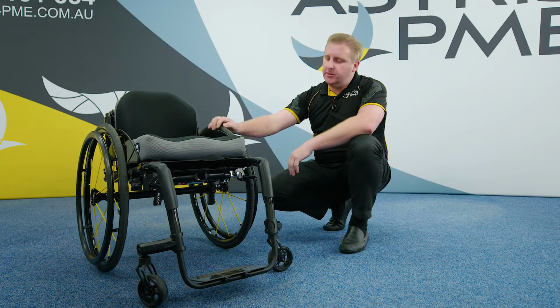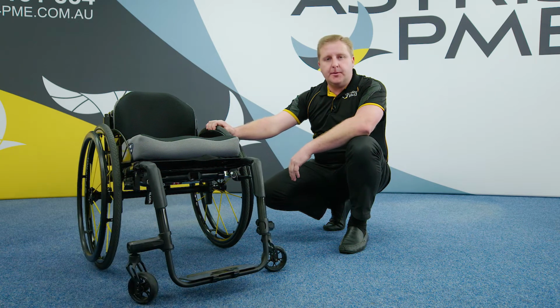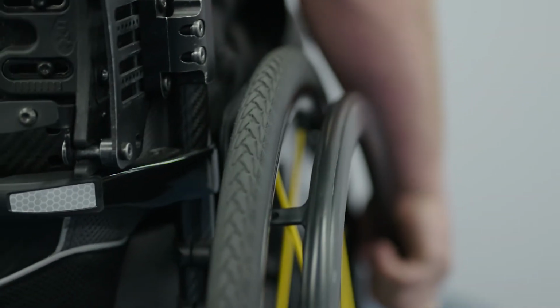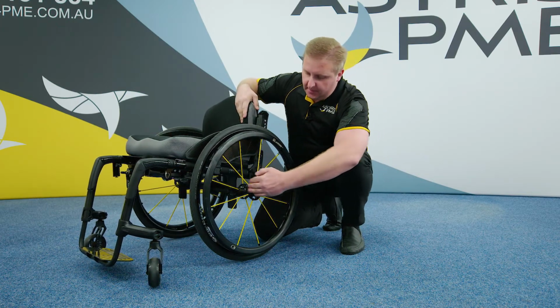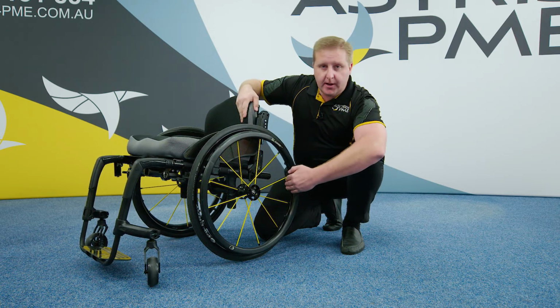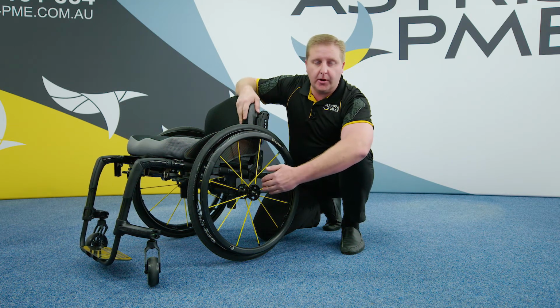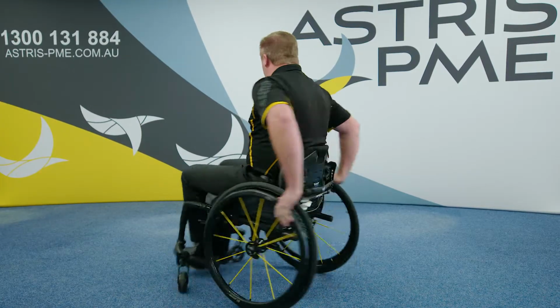The centre of gravity of a wheelchair, often referred to as COG, is important in the user setup of a wheelchair. This can have a long-term impact on the client's shoulder wear and tear and use over many years. Most manufacturers have an adjustment of their centre of gravity on a wheelchair. The further forward you have it, the more tippy the chair will be. The further back you have it, the more stable it will be. It's important to find the centre of gravity that suits your client so there's less weight on the casters as possible. This will mean the chair is easier to manoeuvre and turn and easier to push.